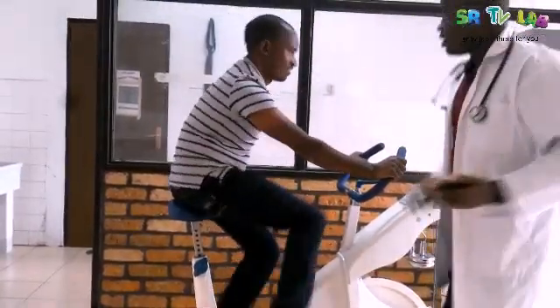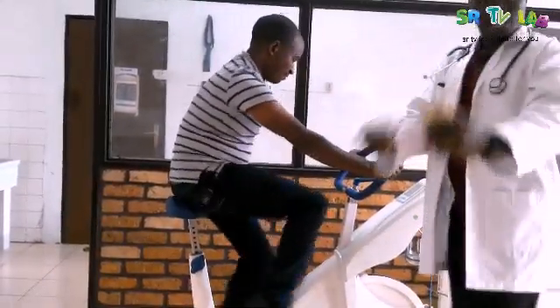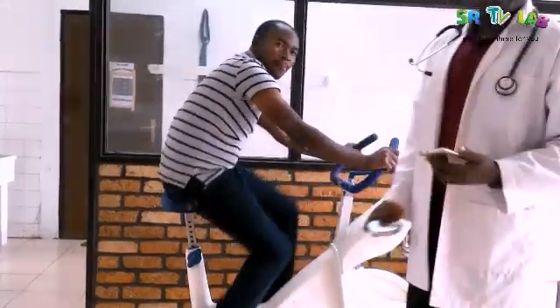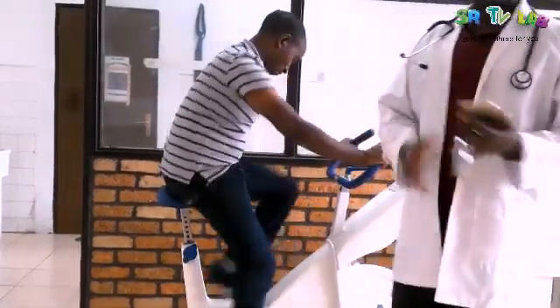We are climbing the mountain now — we are doing exercise! It will help to encourage your patient. And actually, this is not only done for patients but also for normal people, to see how exercise can affect their blood pressure.